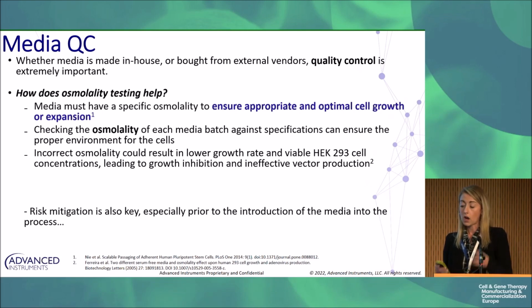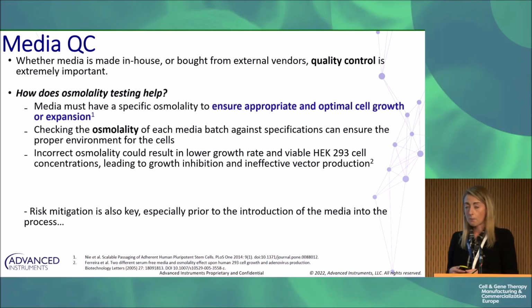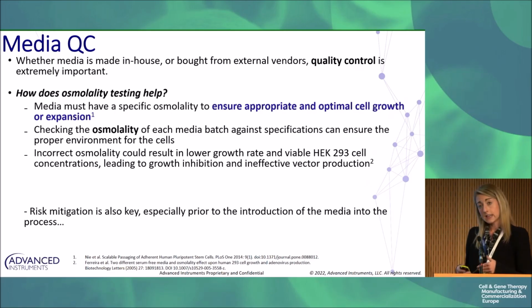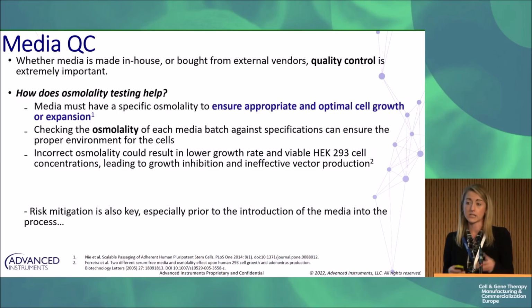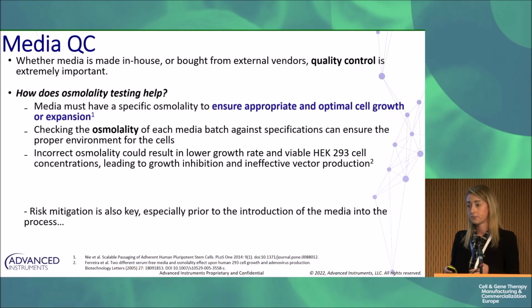They were hydrating their media in-house, making their own batches, and they could not figure out why their cell cultures were dying. The viable was low. They tested everything. What was happening in this solution? To cut a long story short, basically they found out that the purified water system that they were hydrating their media with was actually contaminated with lead from the system. So those pipes were actually adding lead into their media.